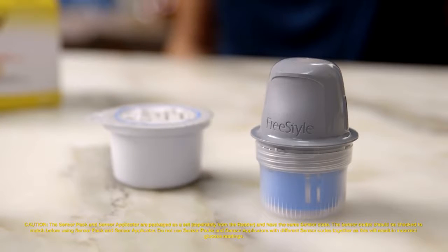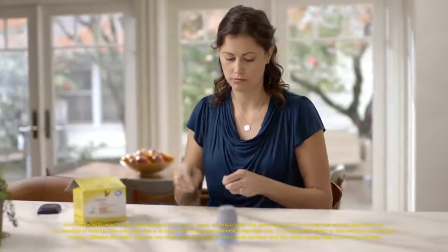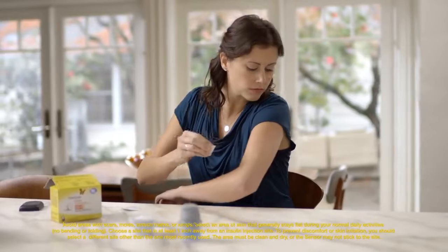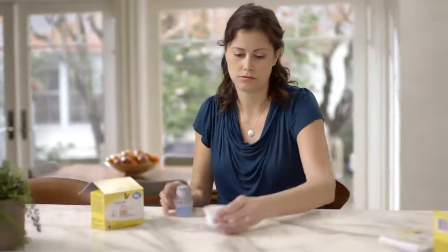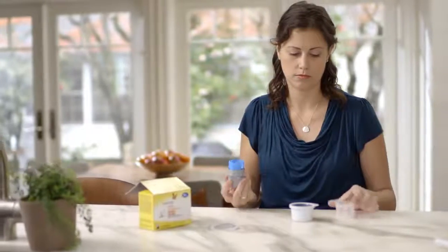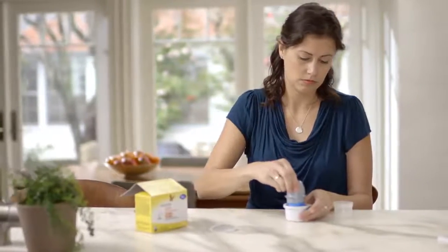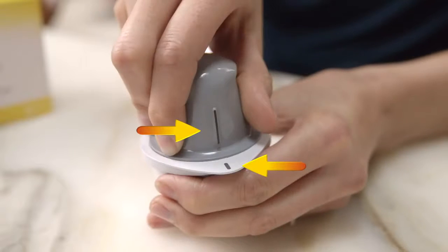The FreeStyle Libre 14-day sensor kit comes in 2 parts, the sensor applicator and the sensor pack. It also contains an alcohol wipe and product insert. Select the site on the back of your upper arm where you will clean it with the alcohol wipe and let it dry. Peel the lid completely off the sensor pack and unscrew the cap from the sensor applicator. Place the sensor applicator into the open sensor pack and line up the dark mark on the applicator with the mark on the pack. Press down firmly on the sensor applicator until it comes to a stop.